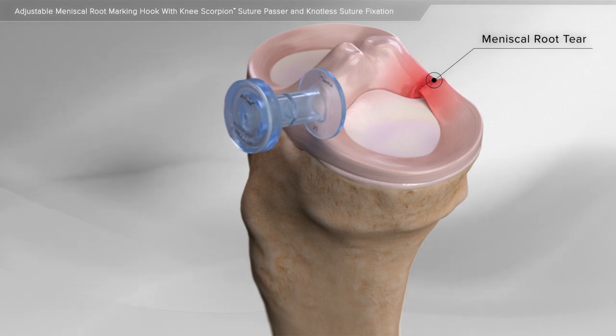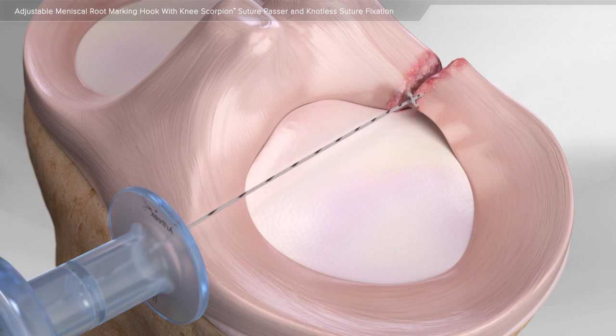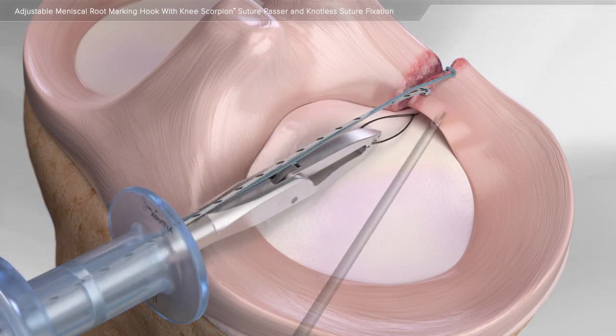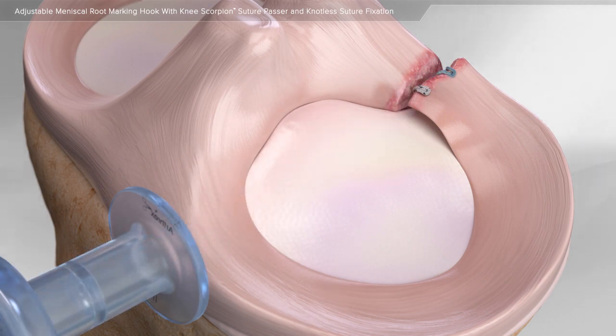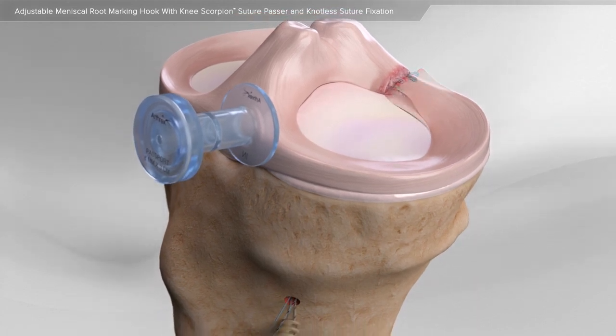Your surgeon will determine if the meniscus tear in your knee can be repaired surgically. Through minimally invasive surgery, using a small camera, surgical instruments are used to place sutures through the meniscus root. Once the sutures are passed through the injured tissue, they are pulled through a tunnel made in the bone and fixed using a screw-in type anchor.